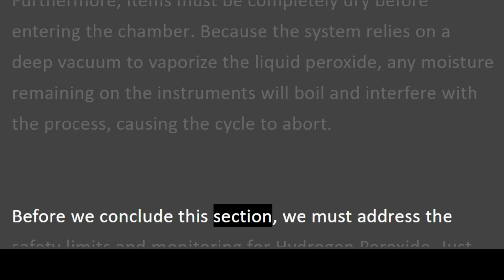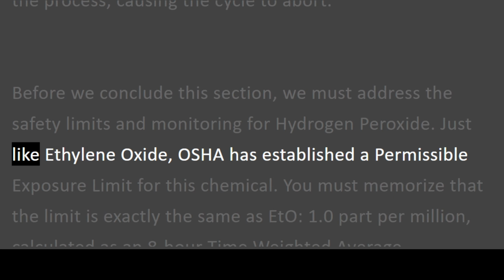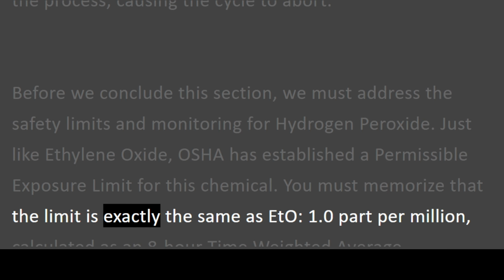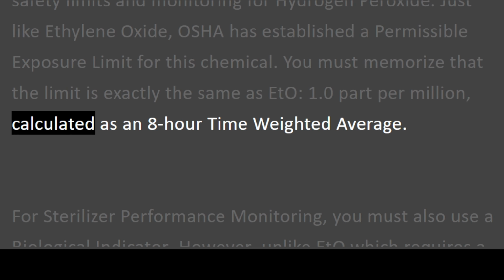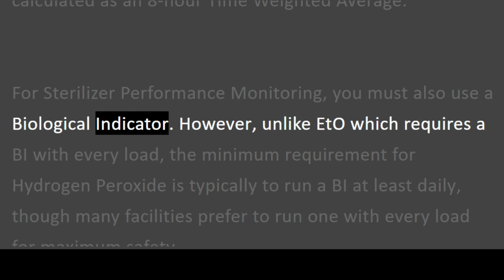Before we conclude this section, we must address the safety limits and monitoring for hydrogen peroxide. Just like ethylene oxide, OSHA has established a permissible exposure limit for this chemical. You must memorize that the limit is exactly the same as ETO, 1.0 part per million, calculated as an 8-hour time-weighted average. For sterilizer performance monitoring, you must also use a biological indicator.